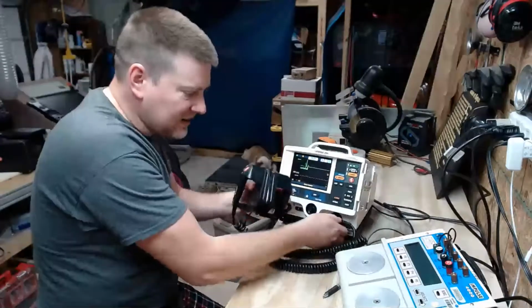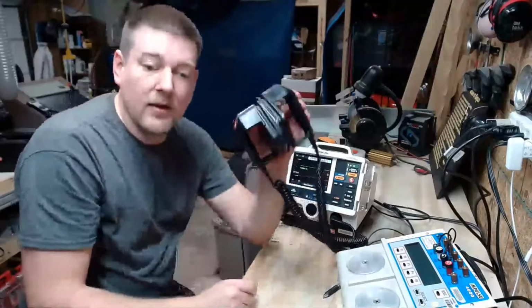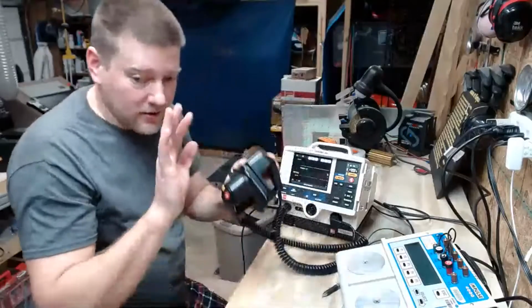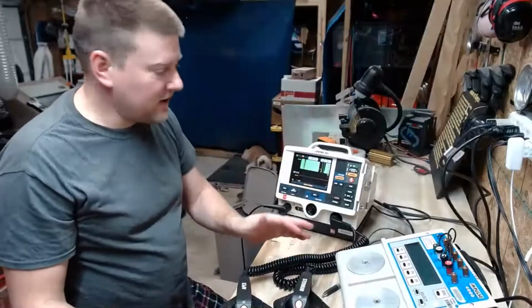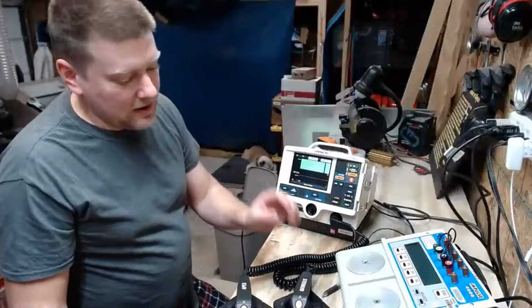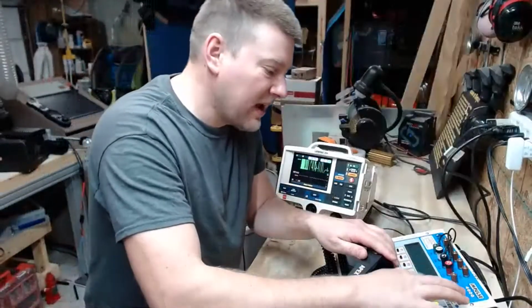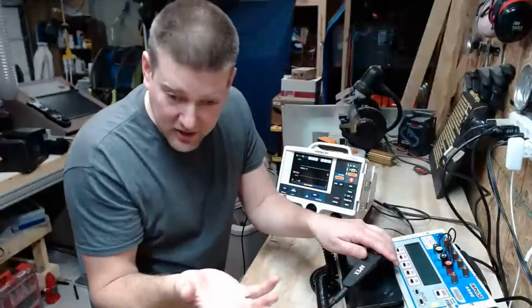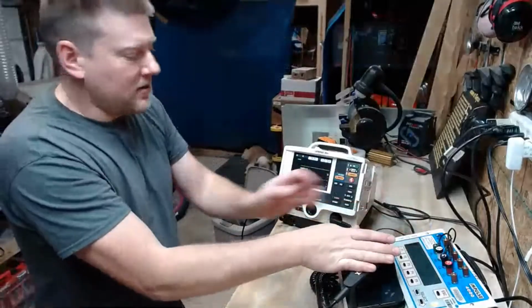So if you wiggle this connector around and you start seeing those lines blippity blip like that, that is when you either have a bad connector or you have bad paddles. So your first test, when you walk up and you're going to test your paddles, put them together, wiggle your cabling around, and check that bad boy and see if it's okay. And then from there, I'm going to set my analyzer back to defib, and I'm going to put on energy this time, and I'm going to measure the amount of output that my paddles are giving me.